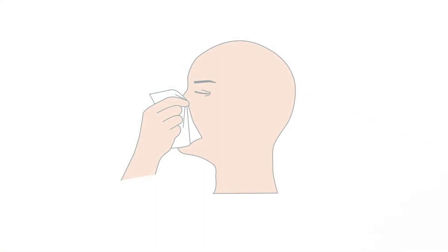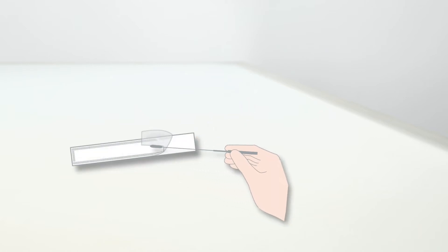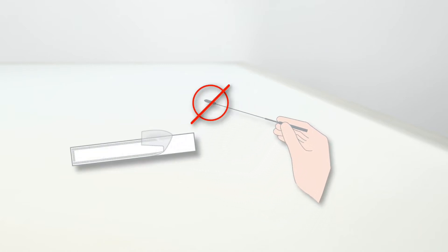Blow your nose briefly into a tissue. Remove the swab from its packaging by pulling apart the loose ends. Remove the swab by the shaft. Do not touch the tip of the swab.